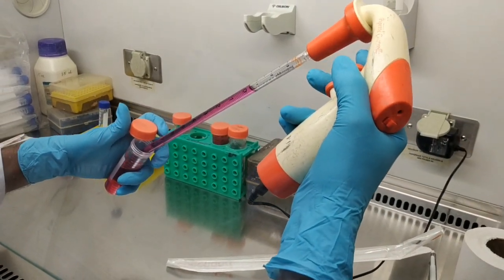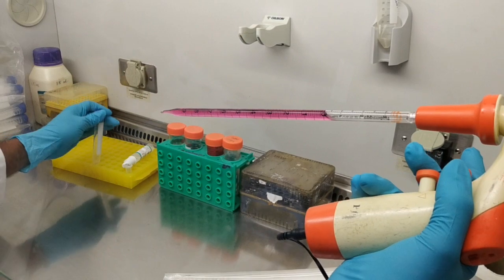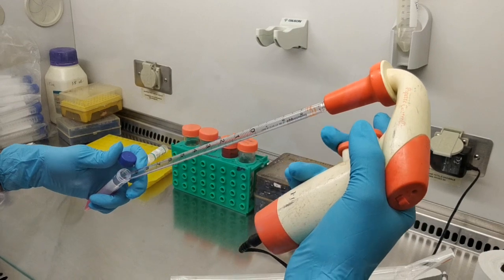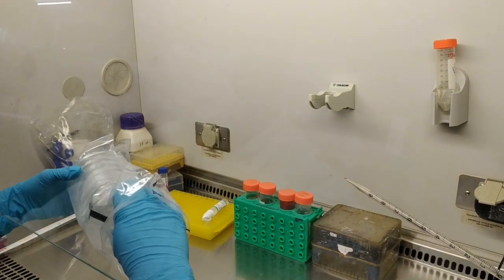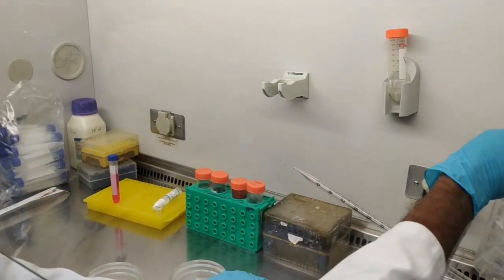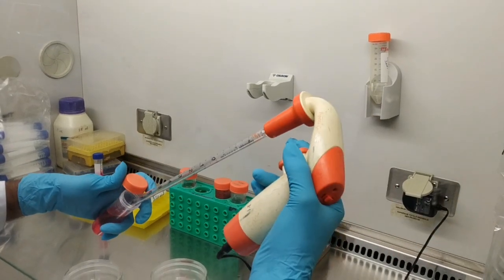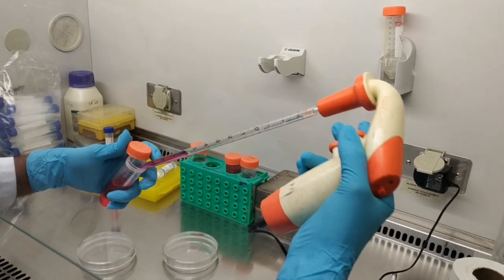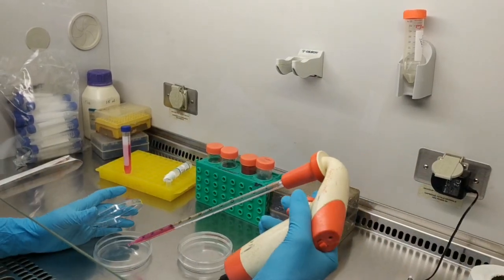Here we are using DMEM high glucose medium to grow the breast cancer cells. These breast cancer cells can be resuspended by using the DMEM medium and then subcultured into different flasks based on our experiments. So here we are using 100 mm dishes, which require 10 ml medium, and we completely filled each plate with 10 ml medium, and then we added the resuspended cells into it.